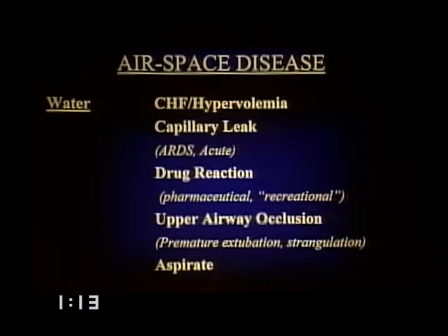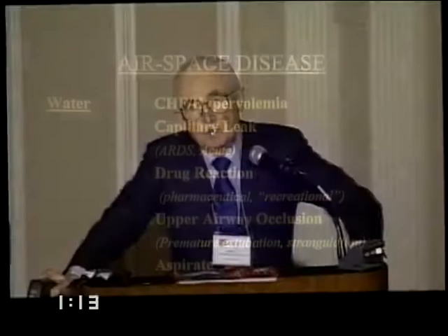I referred in an earlier slide to upper airway occlusion. Premature extubation is probably the commonest cause of edema for that reason. Strangulation we will see occasionally, and that can be intentional or unintentional. And aspirate. Now, about aspirate, I will have to remind you that the airspace opacity that we see with aspirate is not necessarily the aspirated fluid. For the most part, it is the capillary leak that occurs as a consequence of the aspiration.